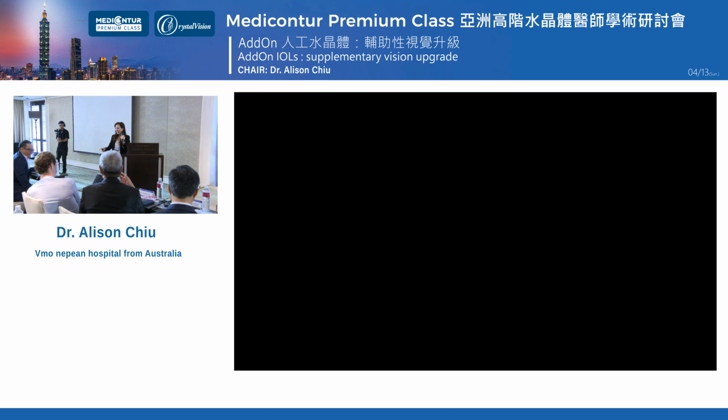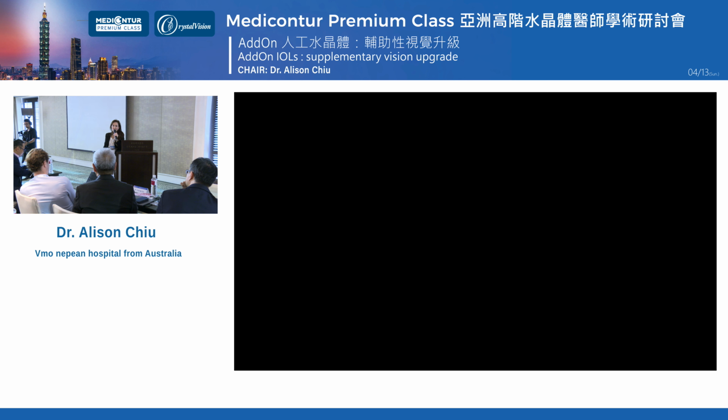So we started out using the SML lens for patients with advanced macular degeneration to enable them to improve their reading vision. And one day in conversation with Dr. Gabor Charioth, he suggested, why don't you try using it in patients with high myopia? Because patients with high myopia, they like to read like this. If you put in a trifocal lens and you tell them to read like this, they say, I can't see. They want to read like this because they've been doing this for decades. And also they're reading Chinese characters, which for us in Australia, it didn't automatically occur to me, but they need much better near vision than what we expect.